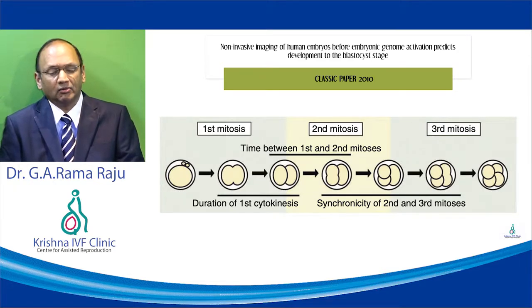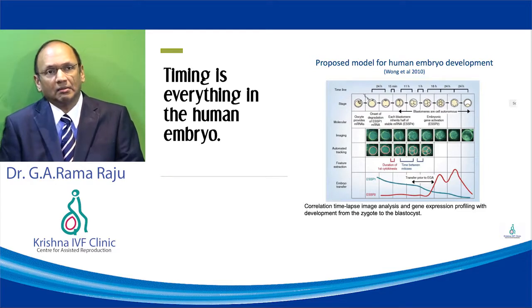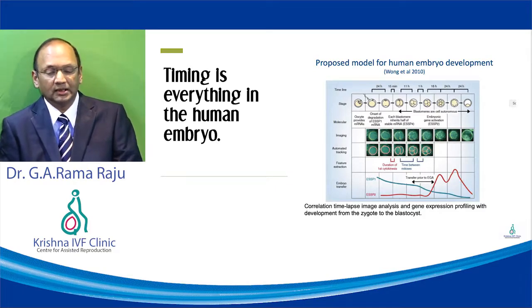In subsequent work, he went on to do mRNA and gene studies to look at which genes are activated at different timelines. Here you see the timelines and the genes that are activated, and this happened in 2010.